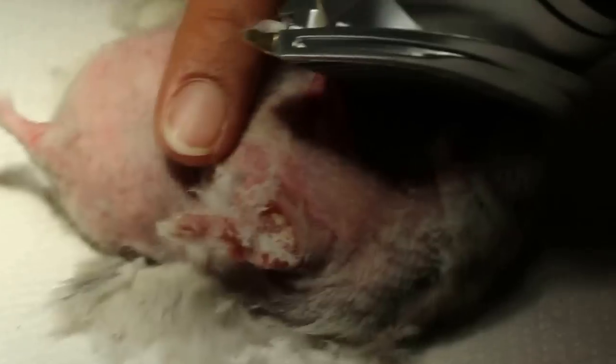Then we just take the ultraviolet light to quickly check and see. Just switch on — put here. I'll put there first. So we quickly just have a quick check for fungus.